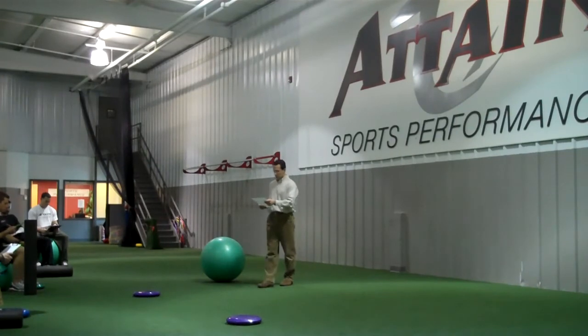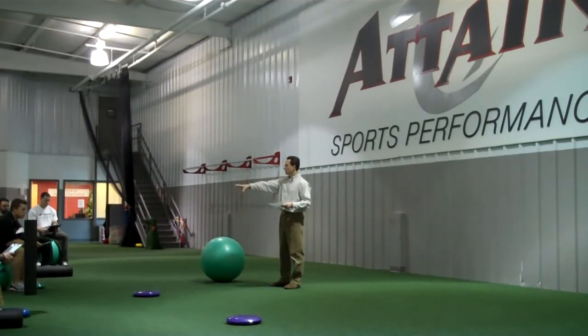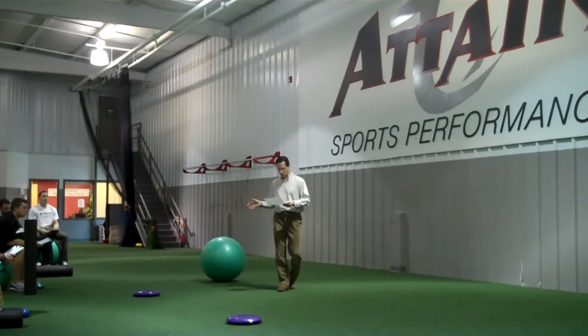His theory is based on proprioceptive exercise, and it utilizes a Dynadisc — a small inflatable disc — along with foam rolls and physio balls. The balls are really only used in the seated position. The Dynadisc is used in just about every position, as well as the foam rolls. You'll see how that comes together in just a little bit.